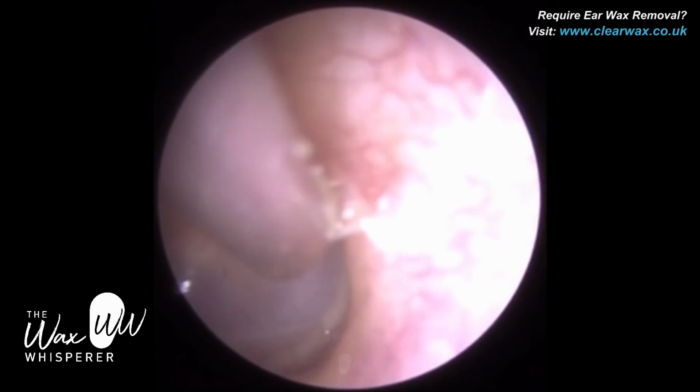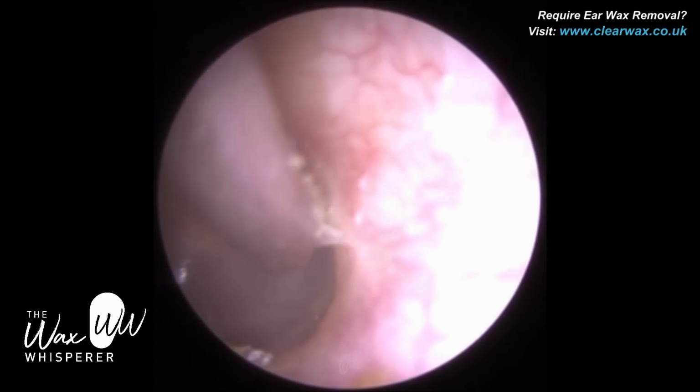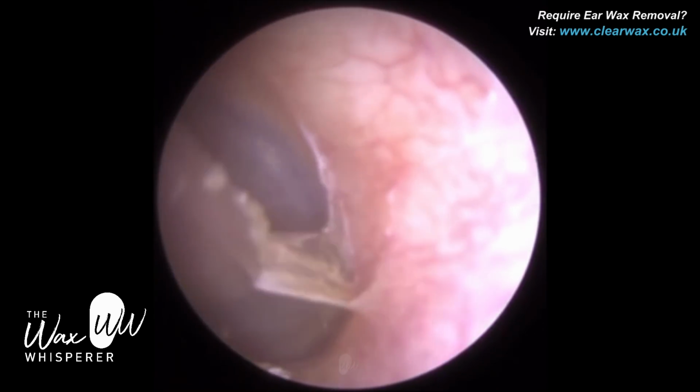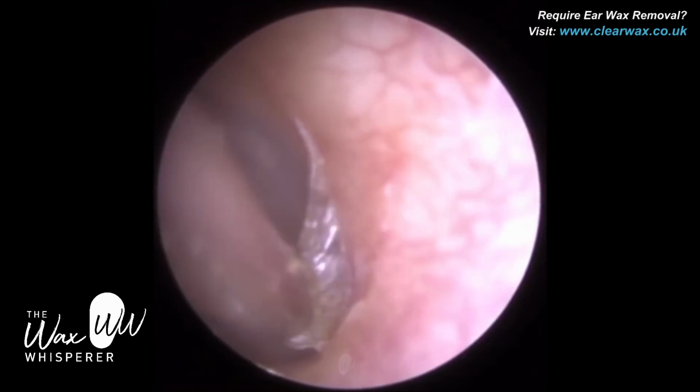I saw another technique today, recording it. I was quite shocked actually how poor it was. There's no way I would be comfortable doing this other than with an endoscope or an operating microscope.